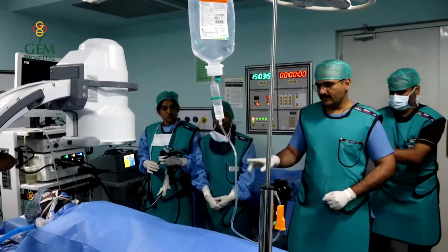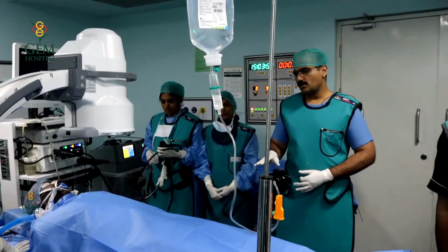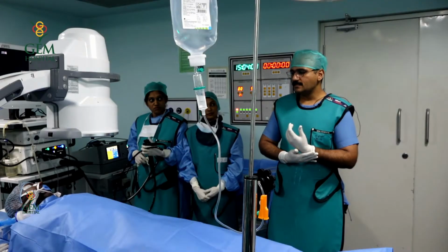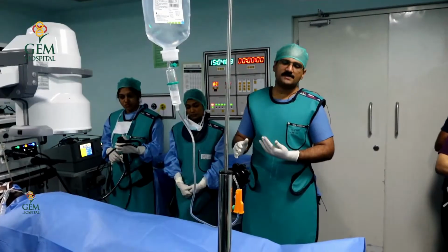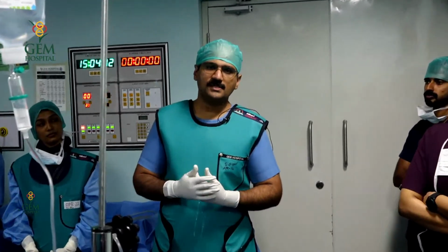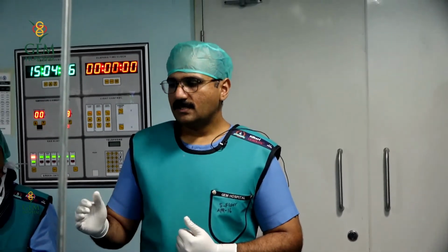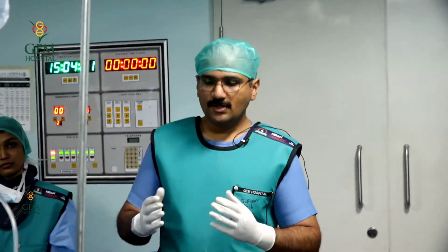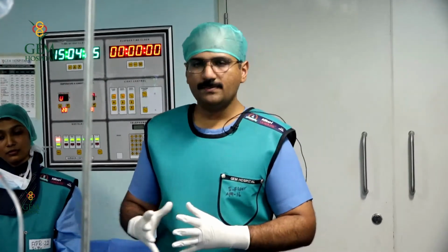Patient, we are always doing in supine position. That is our protocol here because we do a lot more combined cases here in GEM, with combined laparoscopic cholecystectomy with ERCP in the same setting. So conventionally, ERCP is done usually in prone position, in most of the centers across our country and even abroad. But here, since it's easy access to do both the combined procedures in the same position, in the same sitting, that's what we usually practice.